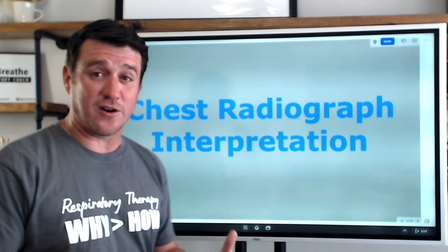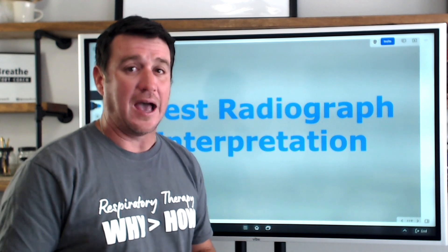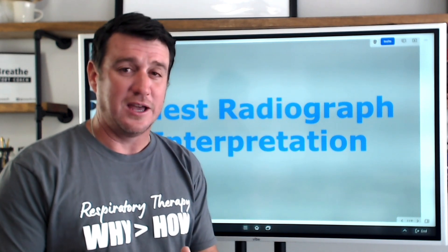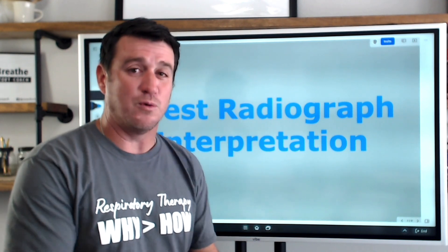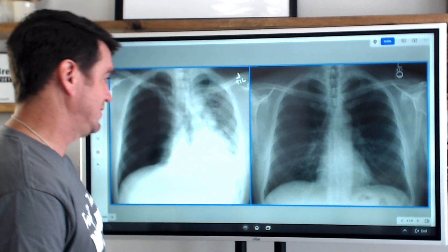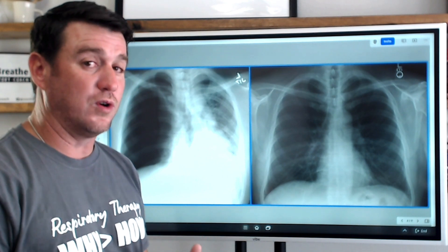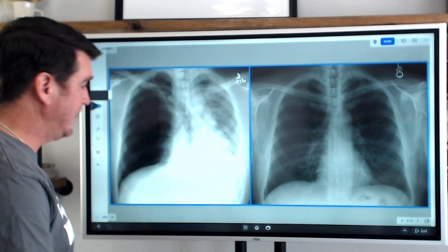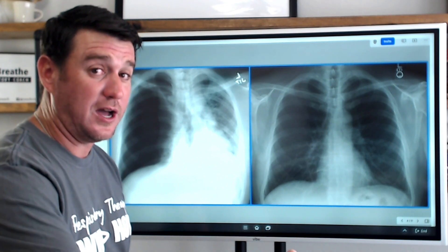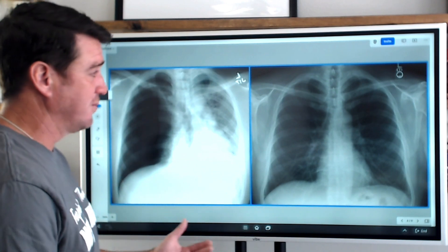We're going to be breaking down another abnormal chest x-ray in this video. Before I break it down, I'm going to give you a chance to test your own knowledge. Can you identify what type of chest x-ray we're looking at? There's one here as a point of reference that's normal, and the other one is abnormal. Which one is which? Go ahead and pause this video right now.